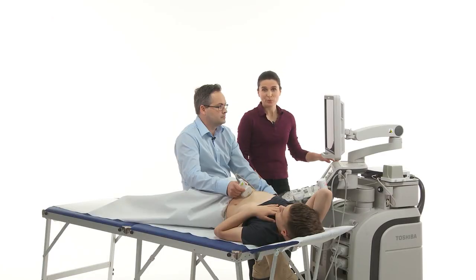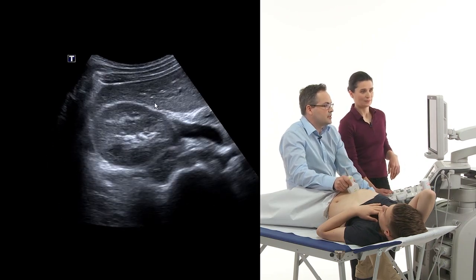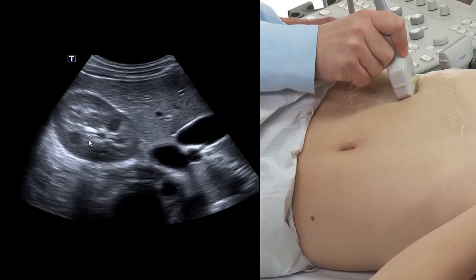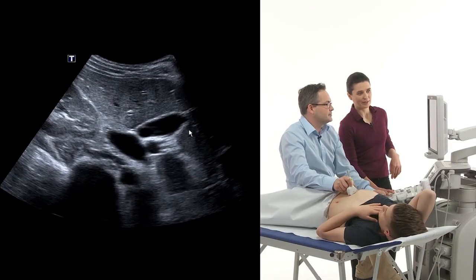And we've got a third approach to scan the gallbladder. This time, we start from another landmark, the right kidney. Please inhale deeply. When we scan the right kidney in cross-scan, we only have to turn the probe slightly to the patient's left side and find the gallbladder over here. It's here already, yes. Perfect.